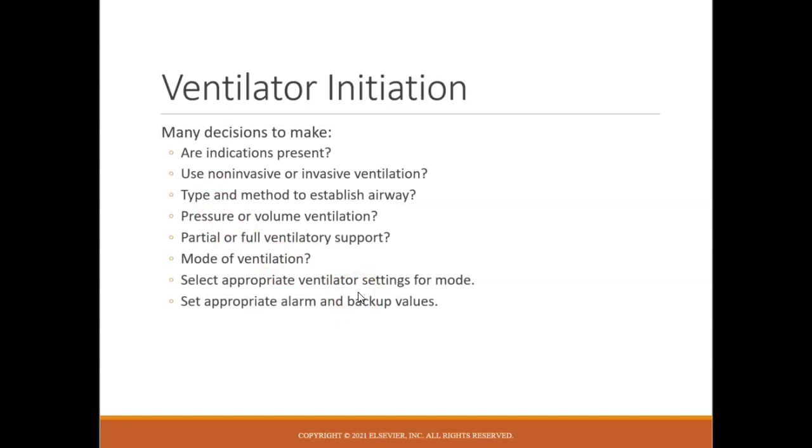Pressure or volume ventilation. So pressure ventilation, meaning I'm limiting the pressures applied to the lungs. We've talked about before that pressure ventilation causes less asynchrony than volume ventilation. So that's the advantage of pressure ventilation. So if I'm really struggling with a patient and I can't meet their flow demands with volume ventilation, I can switch them to pressure ventilation and they might become quite a bit more synchronous. The negative part of doing pressure ventilation is that I lose a lot of direct control over CO2 removal, which we're going to talk about a little bit later on.